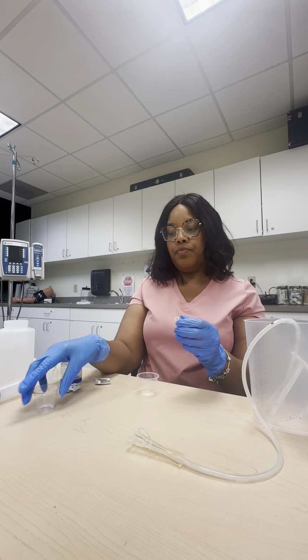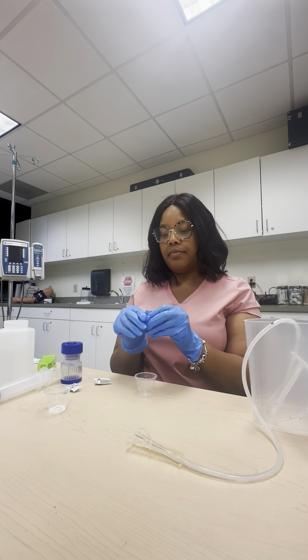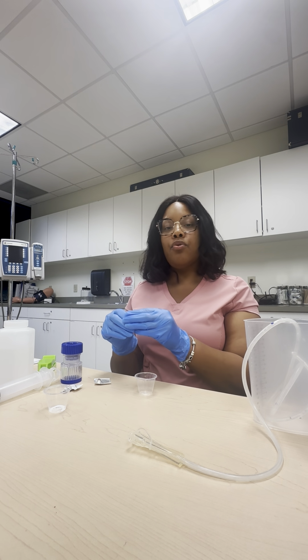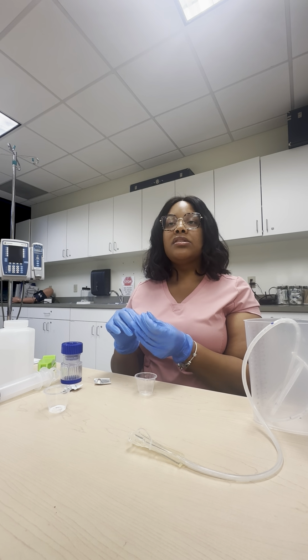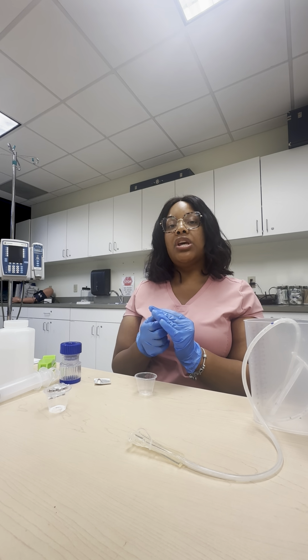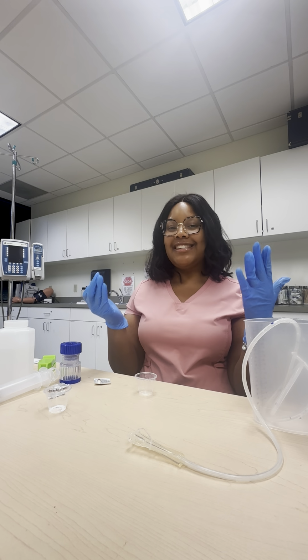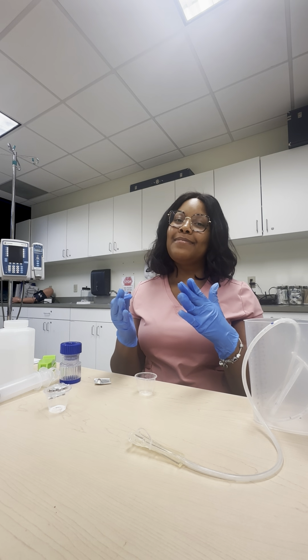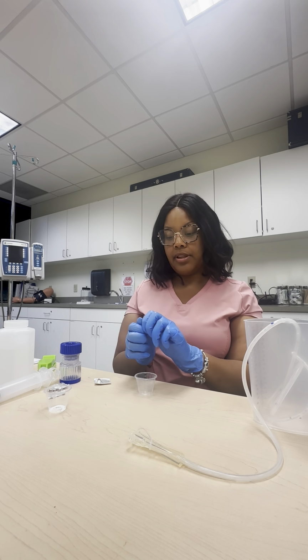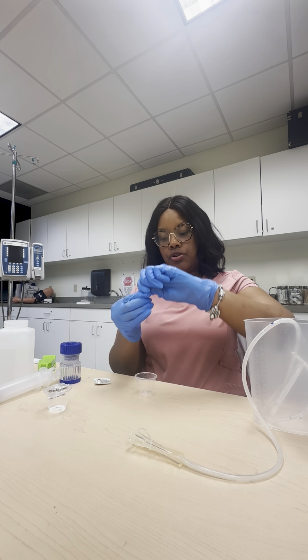So remember, we're going to be giving all our medications separately, so we need a separate cup. So if you are working at a nursing home or something like that, they do have orders where you can crush all your medicines up and put it together, but you just want to check per facility. But what we teach you in nursing school is you're going to crush each medicine up separately and give them all separately. All right, so in order to open the capsule, all you do is twist it open.